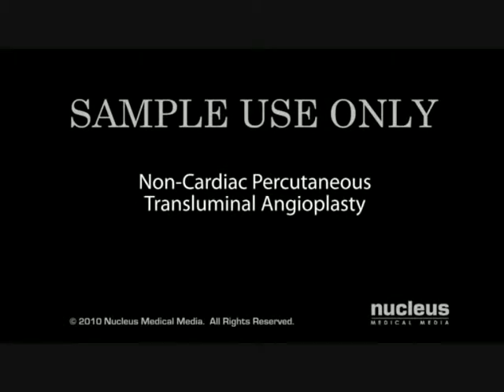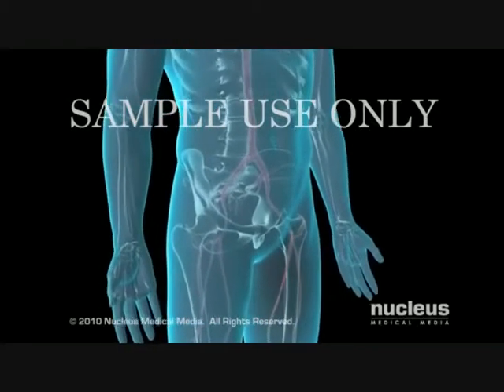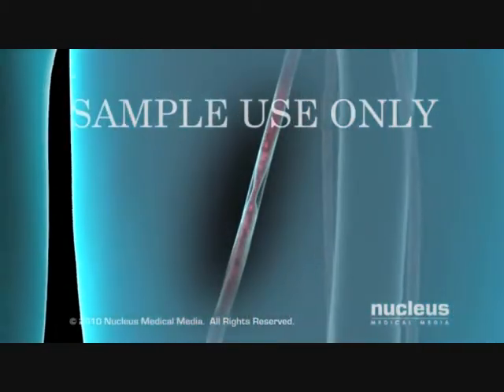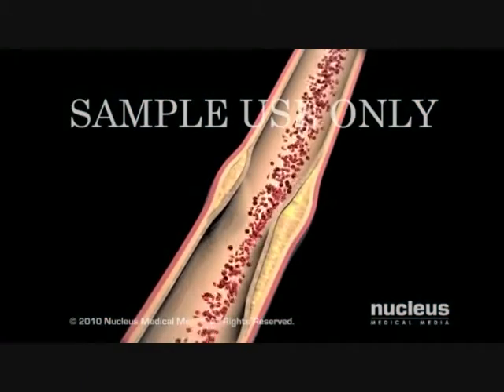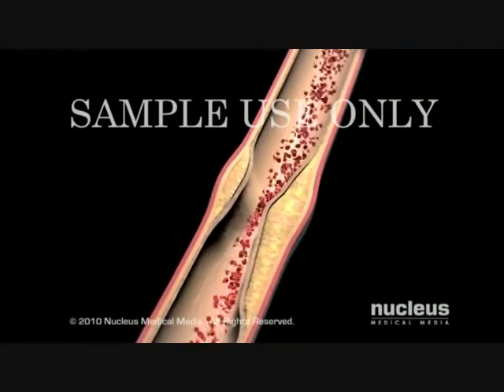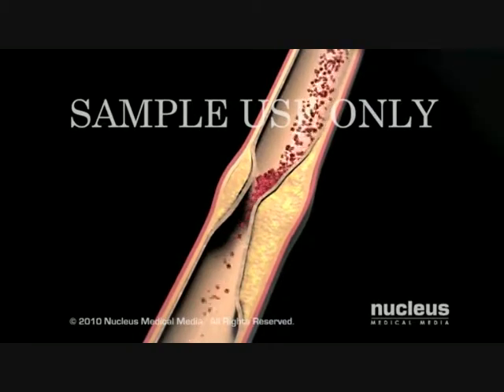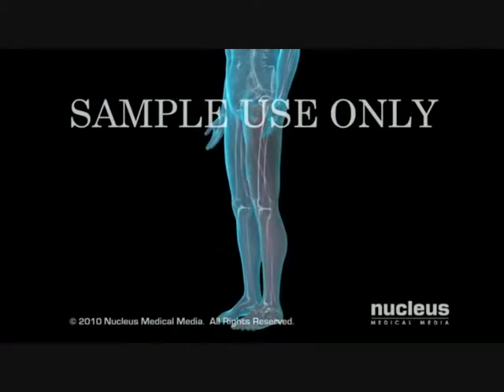Noncardiac percutaneous transluminal angioplasty. A surgeon will perform a noncardiac percutaneous transluminal angioplasty, or NCPTA, to restore blood flow in an artery blocked by atherosclerotic plaque. Fatty deposits called atherosclerotic plaques can build up inside your arteries, narrowing the passageway and interfering with blood flow. This arterial blockage is called stenosis. Insufficient blood flow to a tissue generally causes pain.